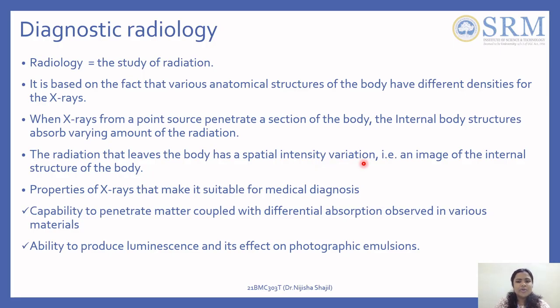So the same X-rays are used in medical diagnosis. Diagnosis meaning that I want to find out if there is any issue or not. Why do I use X-rays? They have the important property that they can penetrate, meaning they can go deep inside, and based on what material it is, they can be absorbed. Different materials will absorb X-rays differently. Second, once the X-rays come out, they can be seen visually using the luminescence principle. I can use it to produce a colored output, and hence I can see it as an output.